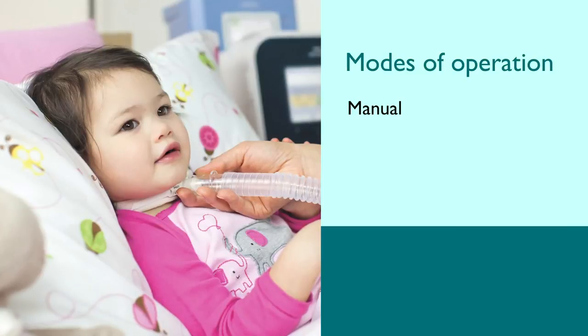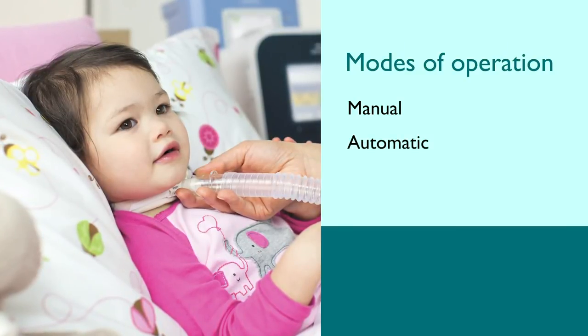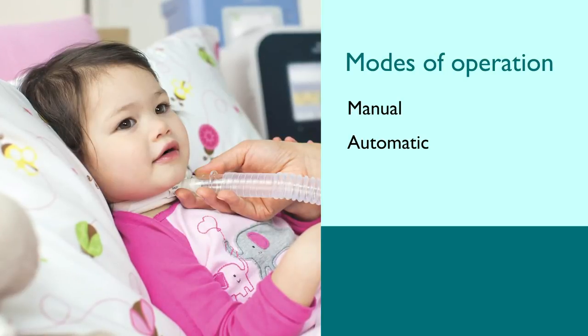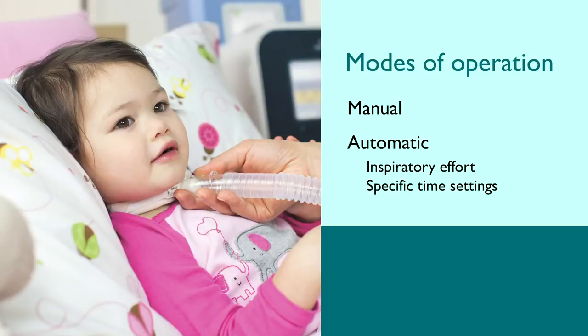CoughAssist T70 can be operated manually, which you have just seen demonstrated, or in automatic mode. In automatic mode, inhale, exhale and pause times are controlled by the time settings entered.